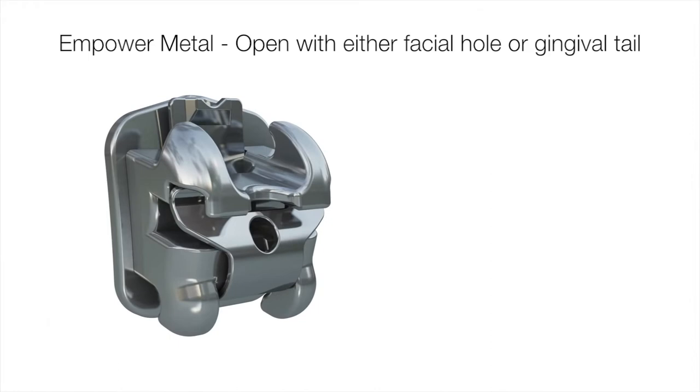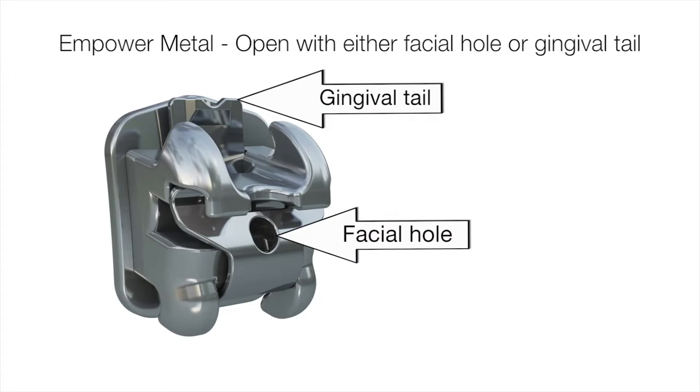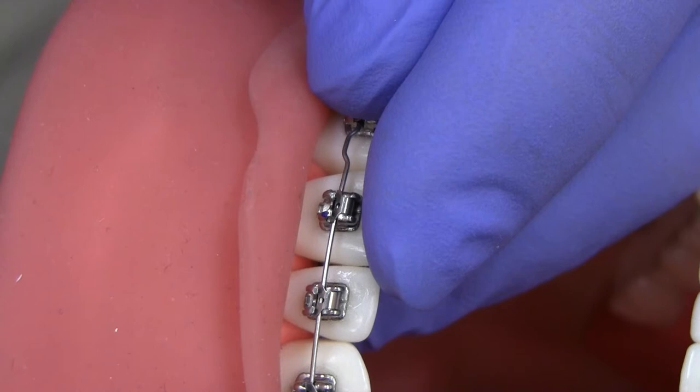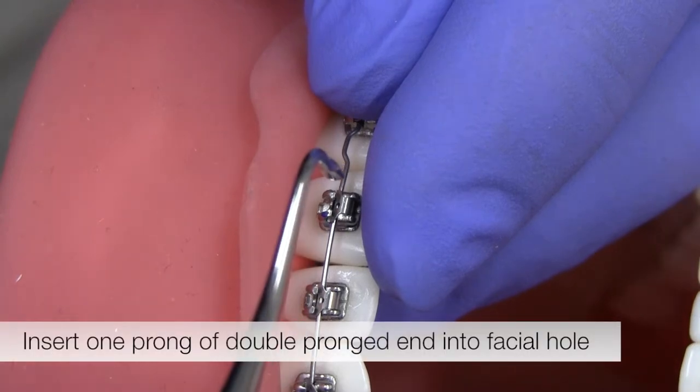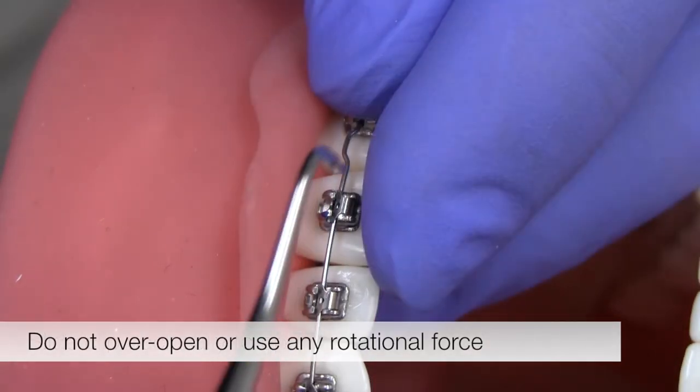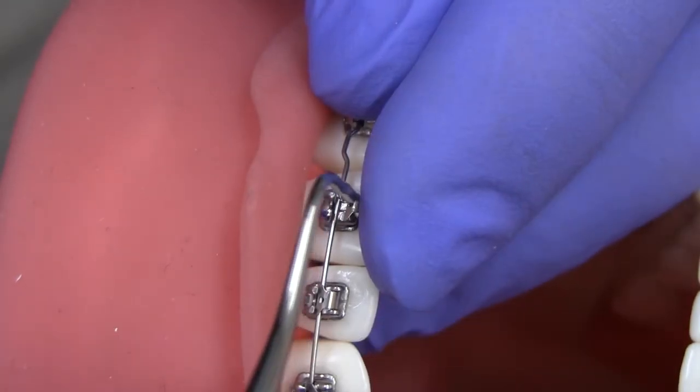Empower metal brackets can be opened two ways: using the facial hole or accessing the gingival tail. Begin by supporting the patient's tooth with a finger and place the finger to also act as a stop limiting the clip's opening. Insert one of the prongs into the facial hole and slide the clip occlusally to open. Don't over-open or use any rotational force as this could distort the clip.